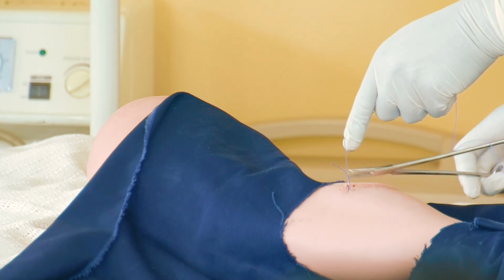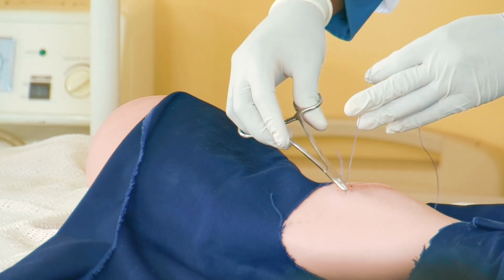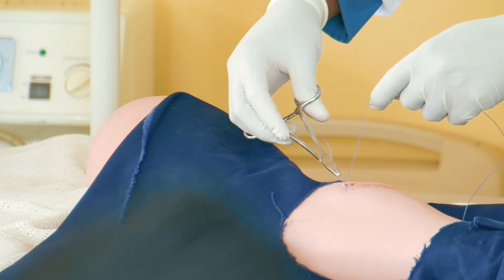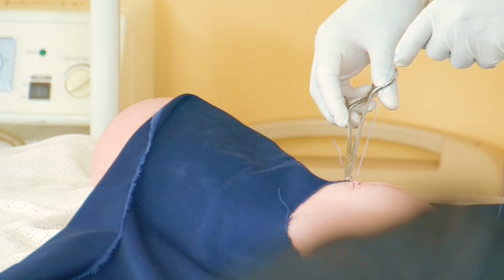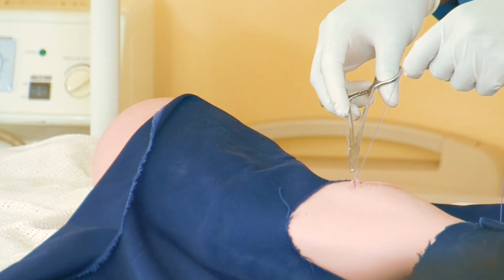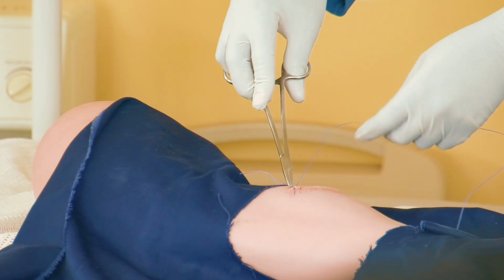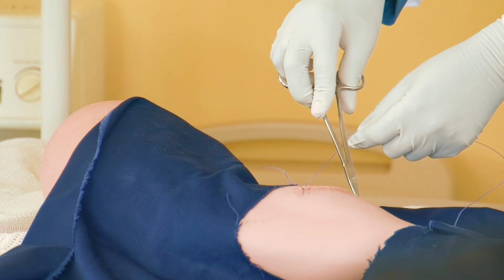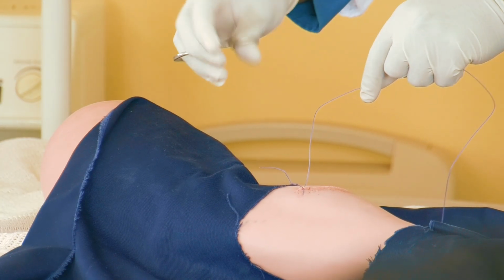Okay? So, then, the stitches, according to your procedure manual, you've been told what you are tying should be on the side. They should not be in the middle of the wound. Right? So, if I'm pulling this here, it means that all the knots are supposed to be this side. It's not a fashion, one here, another one here. Then when you look at such a patient, the one who was doing it didn't do it correctly.